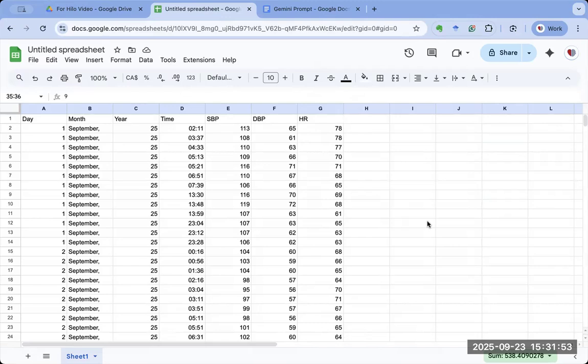And if your medication has been changed just 1 day before, we usually need to wait for 1 to 2 weeks before we can decide whether this medication is working or not. Again, the usual caveats, this is not medical advice. If your blood pressure is really extremely high, then definitely you need to get medical attention soon. But what I would suggest is, first of all, don't get alarmed by single high readings suddenly. One is recheck, and recheck with the arm cuff if necessary. And if it remains persistently high, then that is something to act on.